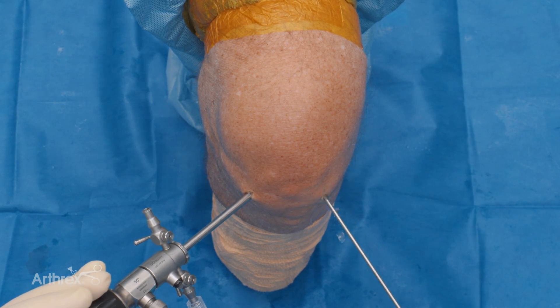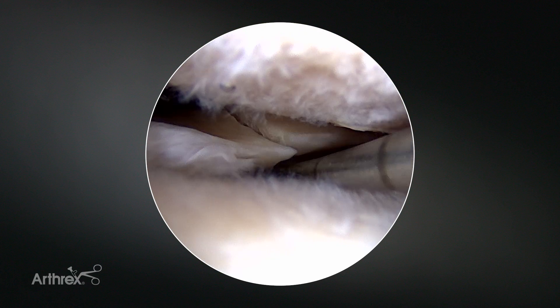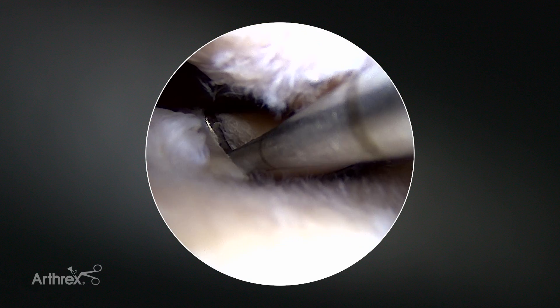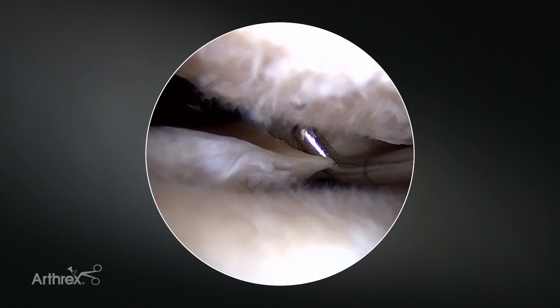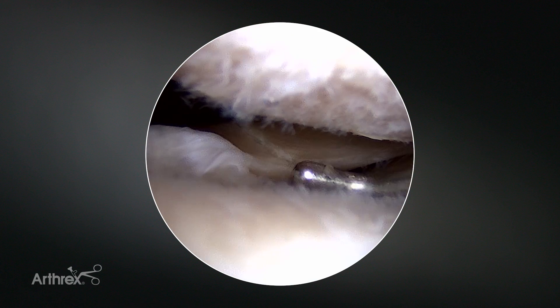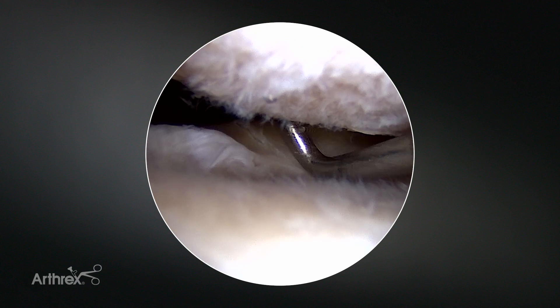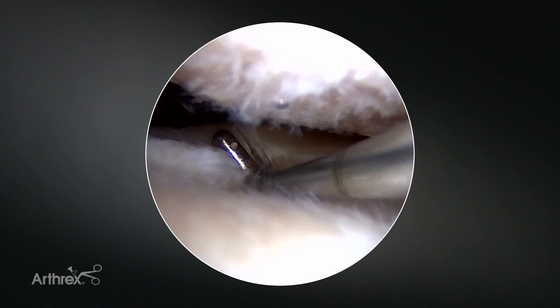The exciting thing about this: the 1.5 is the new, much smaller diameter, very sharp meniscal repair device. We're showing you this tear we created here at the most posterior and central part of the lateral meniscus, kind of mimicking the typical root equivalent tear you would see with an anterior cruciate ligament injury.